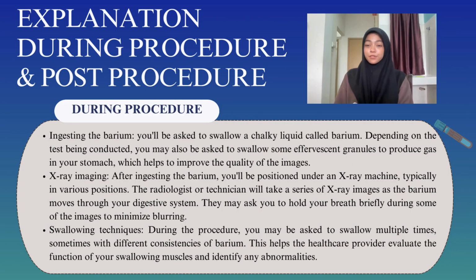We have reached one of the most important parts of my case study, which is the explanation during procedure and post-procedure. During the procedure, I'll divide it into 3 parts: ingesting the barium, X-ray imaging, and swallowing techniques. For ingesting barium, they'll be asked to swallow a chalky liquid called barium. Depending on the test being conducted, they also may be asked to swallow some effervescent granules to produce gas in your stomach, which helps to improve the quality of the image.